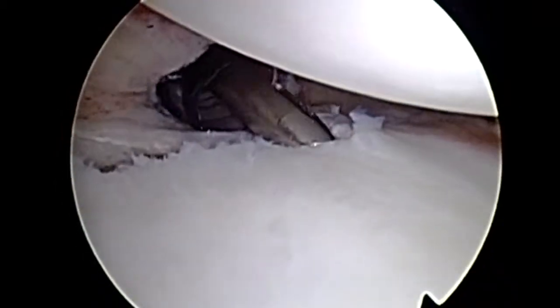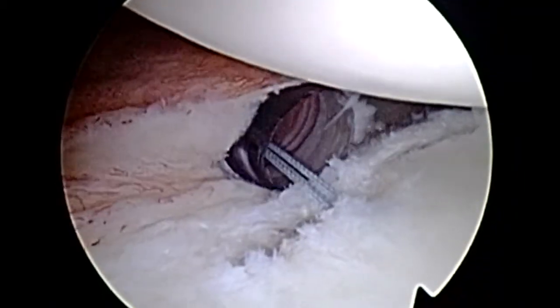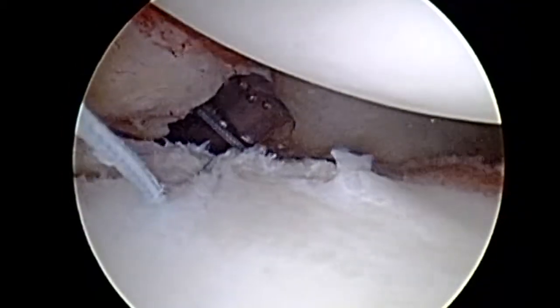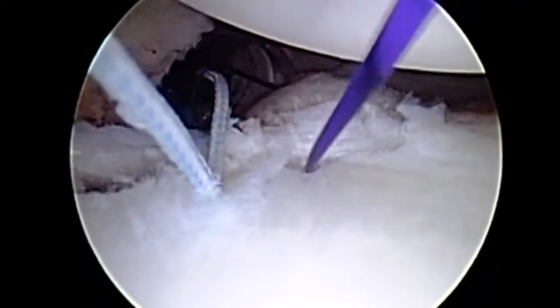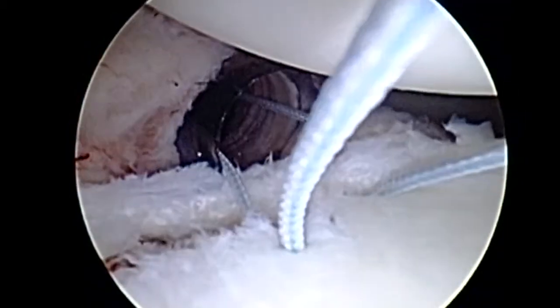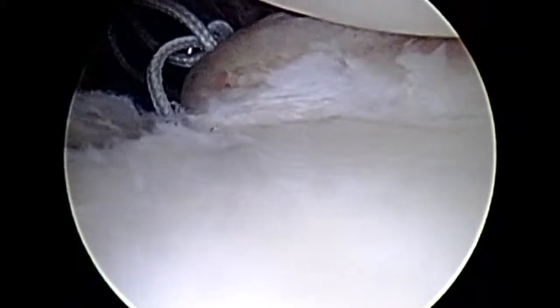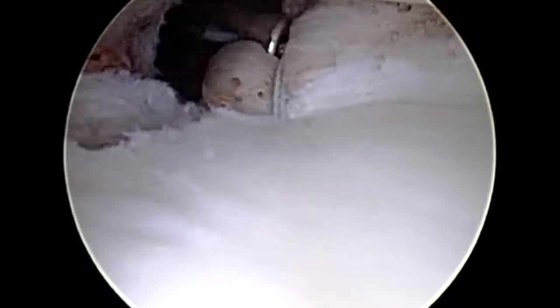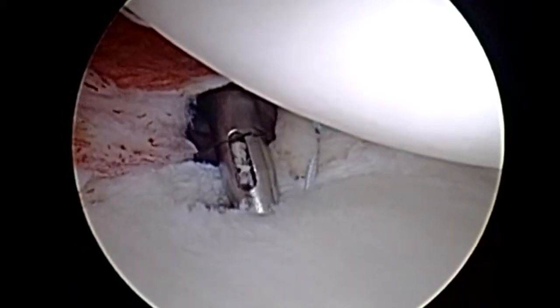Now we begin our reverse Bankart repair. We place our first posterior inferior anchor and retrieve one suture out of the anterior cannula. Using a spectrum suture passer to get a good, healthy bite of posterior inferior capsule and labrum, and then using a standard relay technique, we relay one limb of the anchor through the tissue and tie this down with an arthroscopic sliding locking knot. This ensures not just a reduction from medial back onto the glenoid face, but also an inferior to superior shift — very similar to a standard Bankart repair, except in the back of the shoulder.